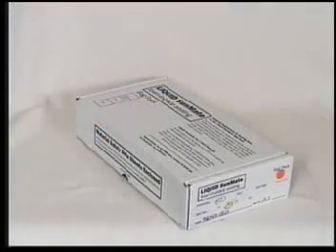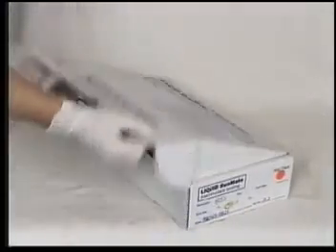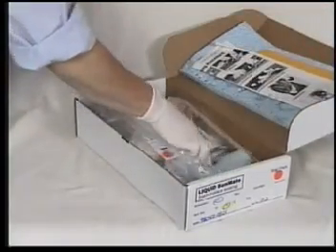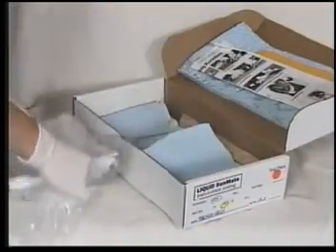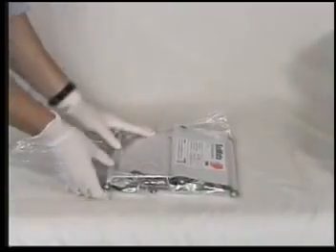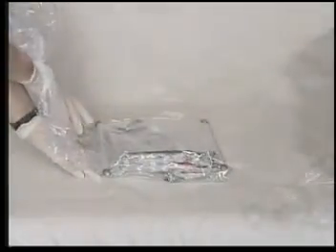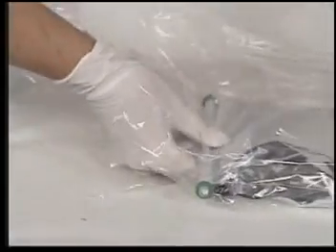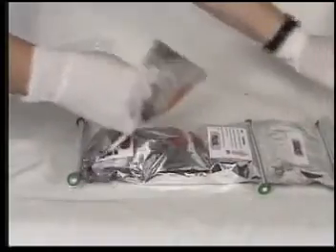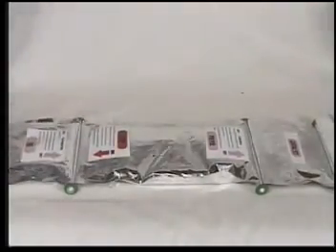The back will be molded using the liquid SunMate bag mix method. Examine the shipping bag prior to opening it. Should there be any evidence of liquid spillage in the shipping bag, do not use it. Simply give us a call, and we'll advise you in how to get a replacement or refund. If everything looks all right, remove the foam-in-place bag pack from the shipping bag, lay it on the table, and examine it for leakage. Review all labels and instructions.